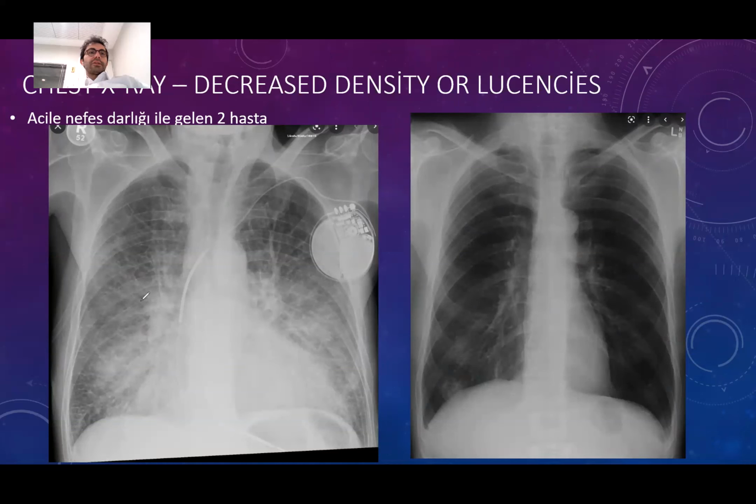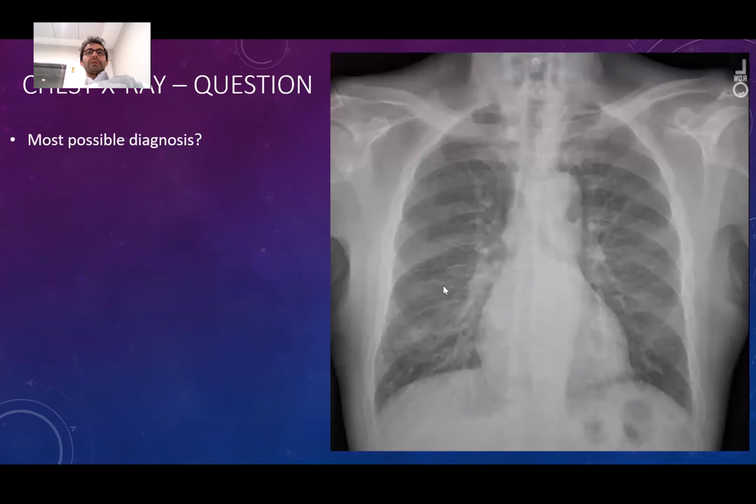With these case discussions, there are very good cases of heart failure. Please look at them. These links that I've sent you, YouTube links. So, doctors, for this whole lecture, it is actually what I'm trying to say. These are findings. There are certain key findings you find on a chest X-ray, and there are diseases. So you have to fill in the between.